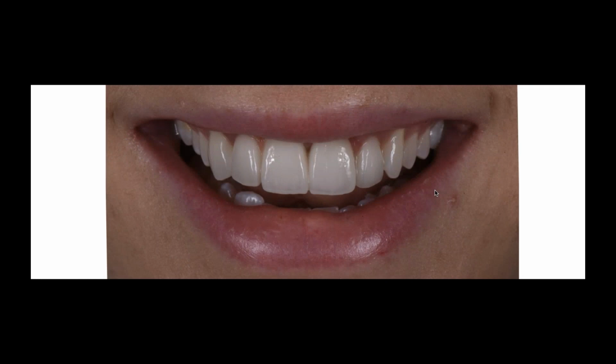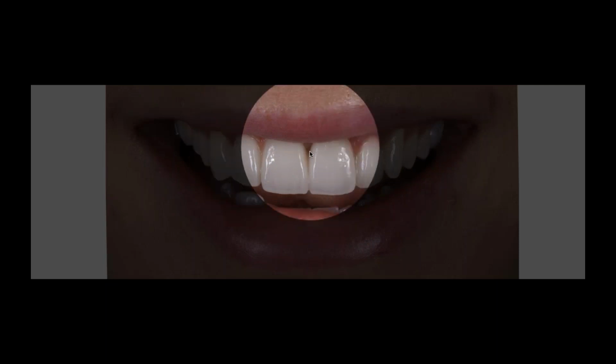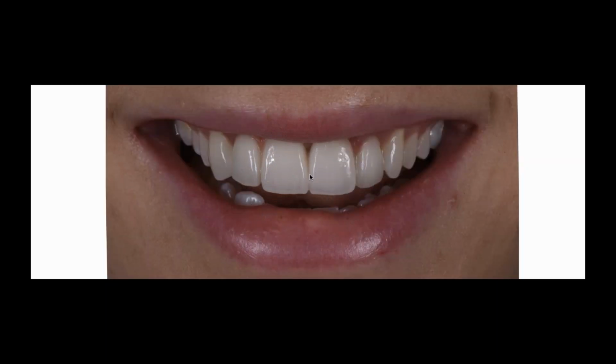I did wind up putting a little bit of pink on her case because I did want to have some papilla that showed that we couldn't develop back in the tissue grafting. And I did use the ceramic zirconia frame. I had no problem using the metal ceramic frame, by the way.